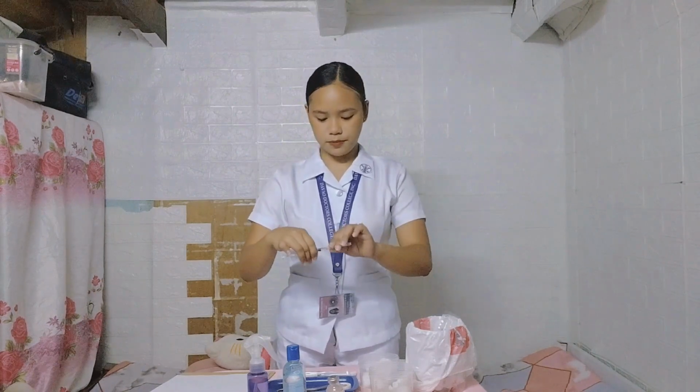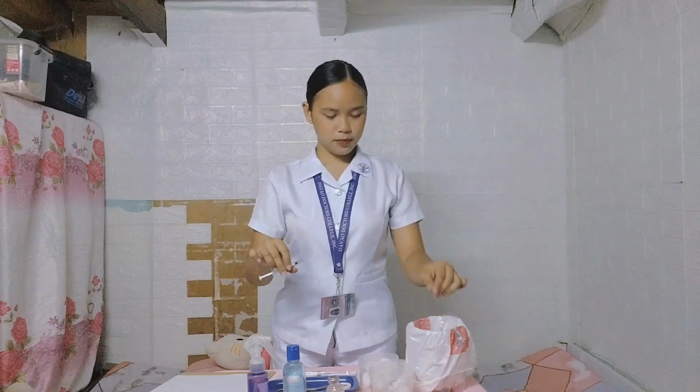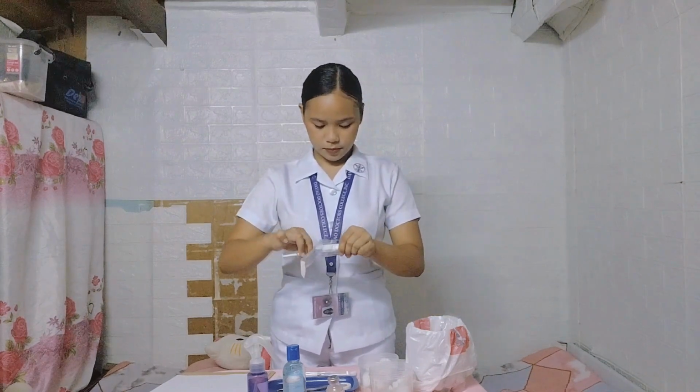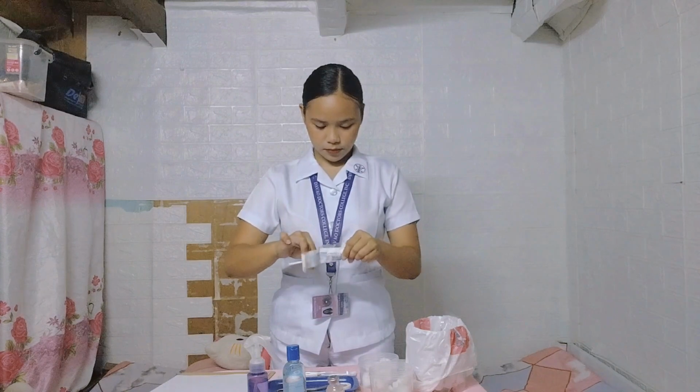After that, remove the aspirating needle and dispose of it in the waste receptacle. Now connect the barrel and the appropriate size of needle. After that, arrange the medication card on the hypodermic tray with the corresponding drug.